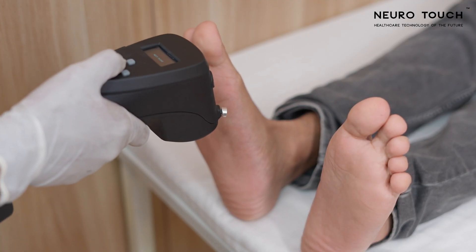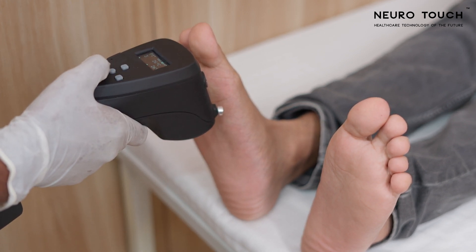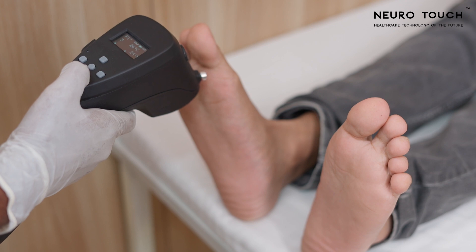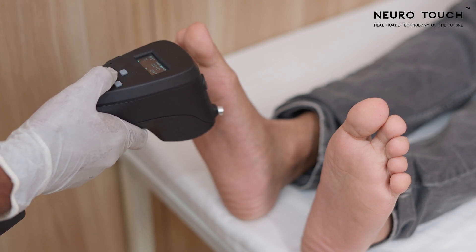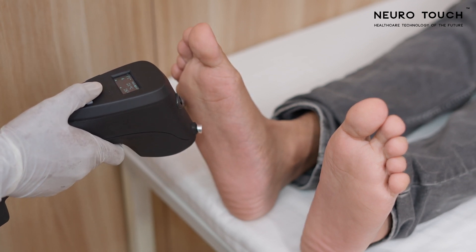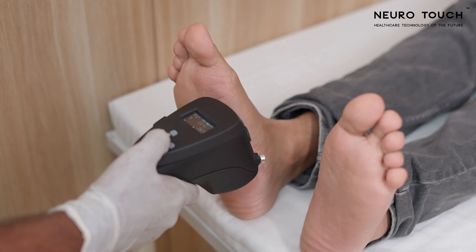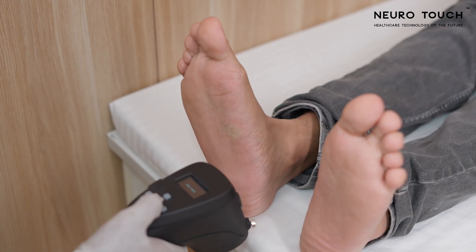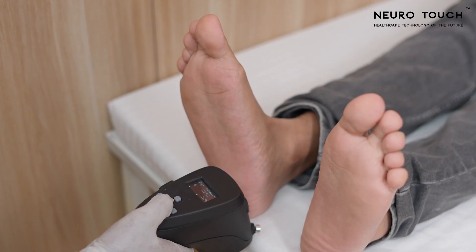Place the cold probe against the patient's test point and take feedback from the patient. The patient should perceive mild coldness when the probe is placed against the test point. Hold the probe against the test point for approximately 3 to 5 seconds, as it takes some time for the patient to perceive the coldness of the probe. If the patient is not able to feel the coldness, decrease the temperature by clicking the down key and place the probe again on the same test point.